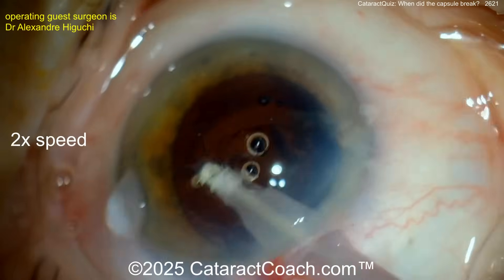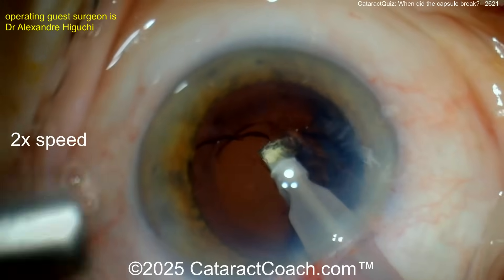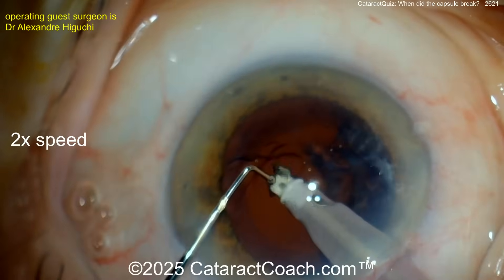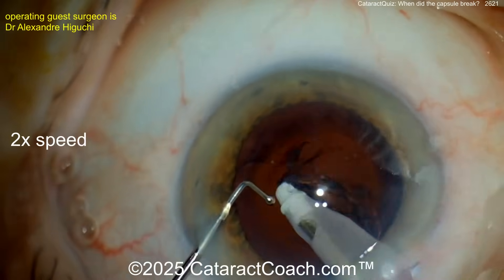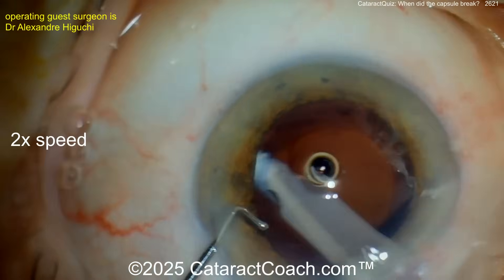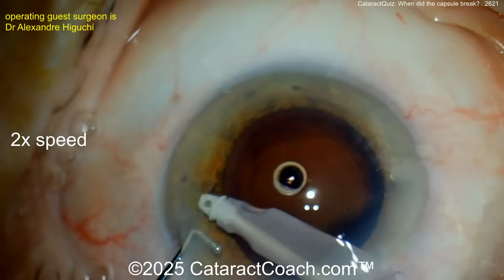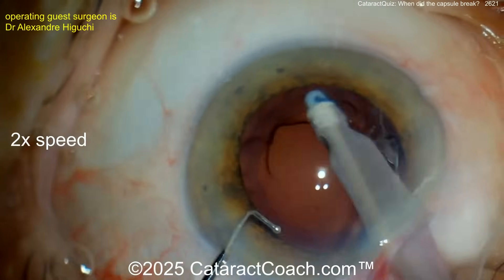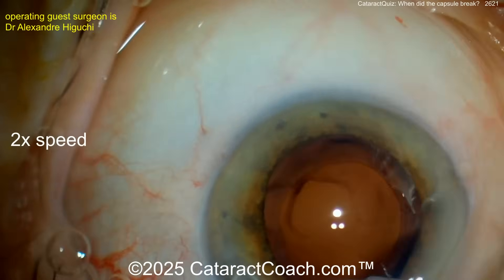The IA probe has a soft polymer tip — not a sharp tip — going into the eye. Watch carefully as we remove these pieces. At this point, is the bag already broken? Look back there — I think the bag is broken centrally. There appears to be an intact anterior hyaloid face, but looking carefully, that looks like an open bag, not just viscoelastic.